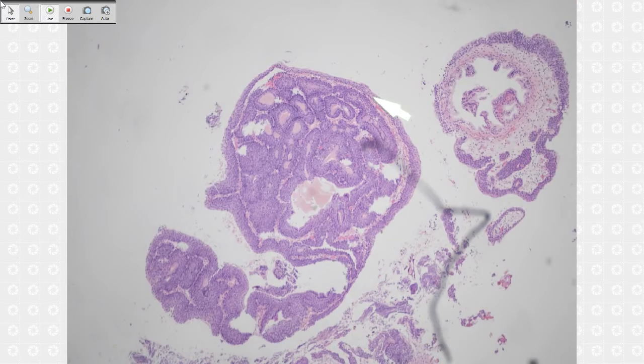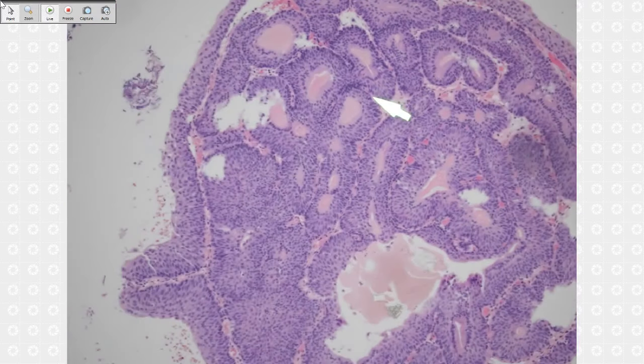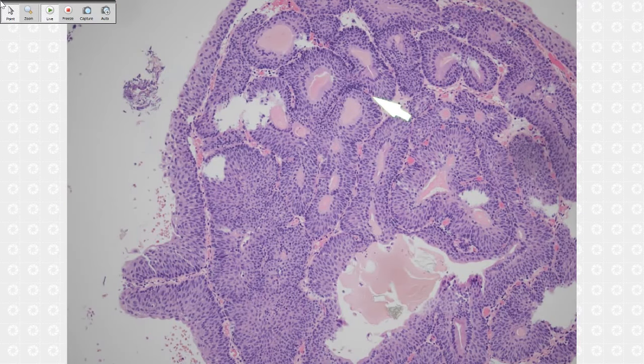Another one. Tell me what this one is. You should be able to pick this up. This is a urothelial biopsy. What's this? Basically, you call the proliferative one Brunn's nests, or another is inverted papilloma. These two sometimes can be a troublesome differential, right?